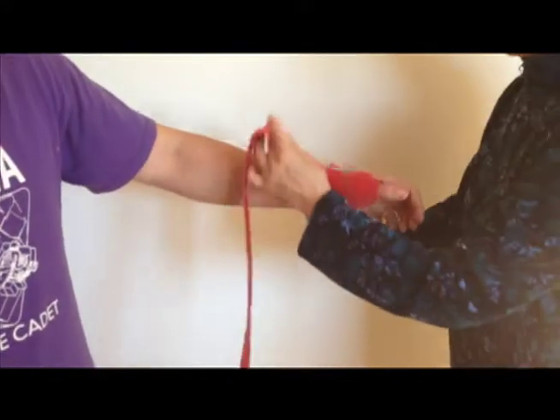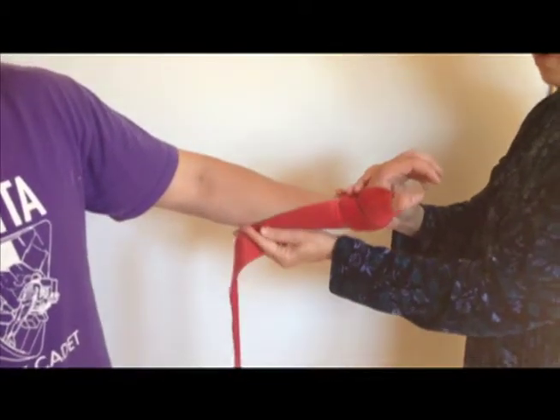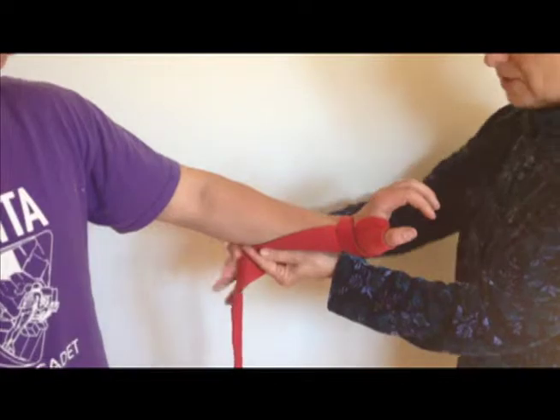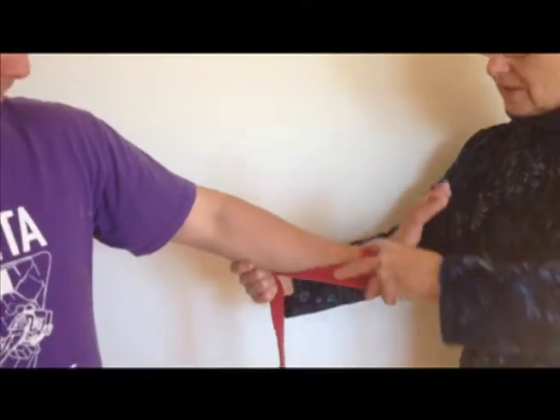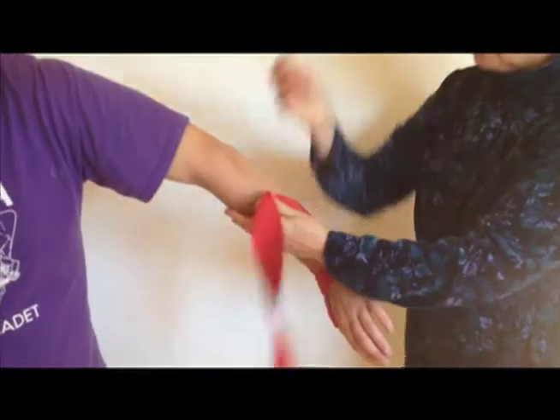I'm pulling on the back of the hand to assist with wrist extension. I'm going to put Bernard in his end range of pronation and wrap one time around his forearm.